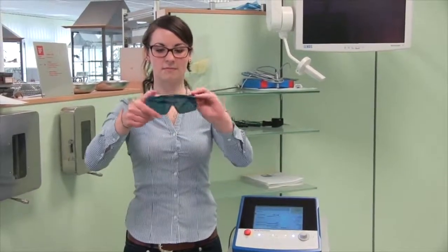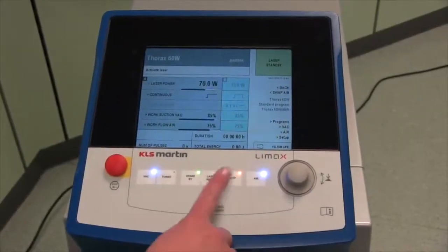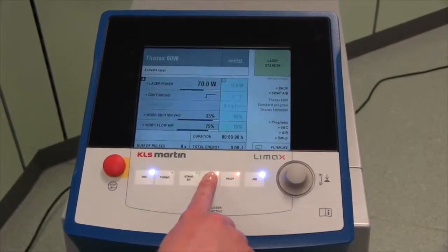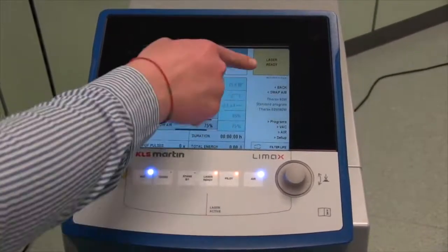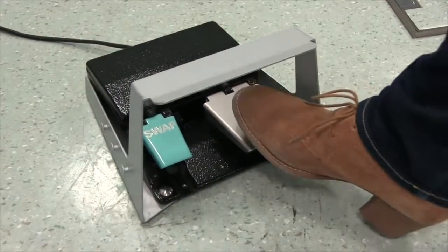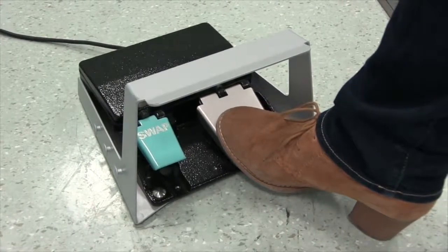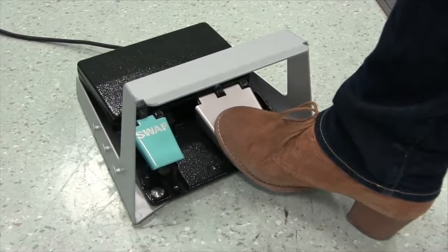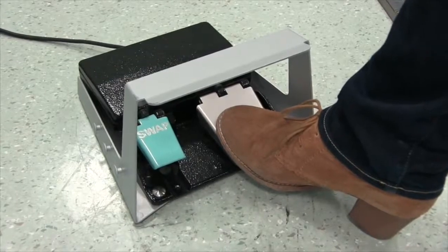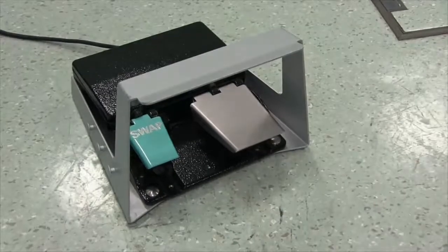Let's get started with the laser therapy. Put on your laser glasses. Press the button Laser Ready. Press the right gray pedal on the foot switch. Press it down completely. As a consequence, laser light is emitted. The vac is also activated simultaneously.